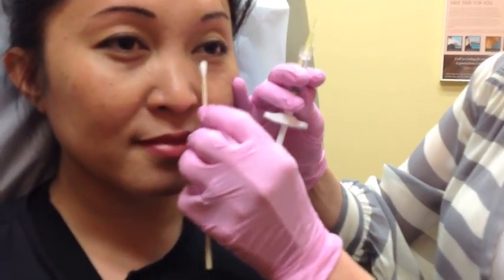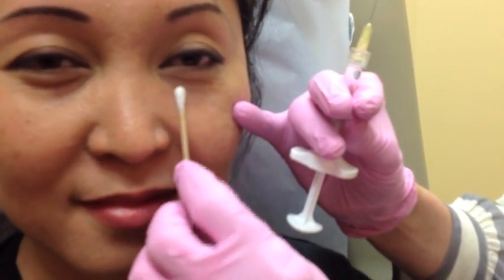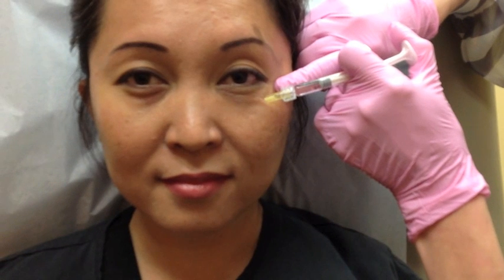Doctor, how deep do you inject the product? So I'm actually going all the way to bone, and then I pull back just a tiny bit because I don't want to be under what's called the periosteum. I want to be just above it. And that's what I'm doing here with Reichel. There are some patients that I'll actually be more superficial with, depending on exactly what their issues are. If they have a lot of wrinkles, then I might be more superficial. With Reichel, she mainly just has some dark circles under her eyes, sort of indentations, or what we call tear trough deformity.